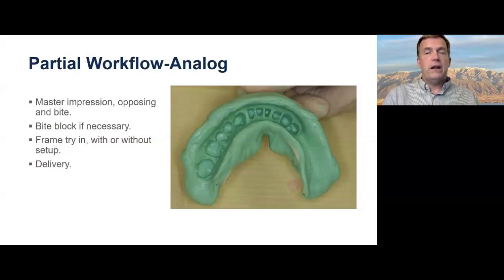If any of you have had to fit them, you know these are very difficult to fit. If they don't fit, you usually have to take a new impression and remake it. Somebody's got to pay for it. It's just not a good thing. So use polyether or PVS just like you would for a crown and bridge case, and make sure you capture all the vestibular borders. You need to give your laboratory enough space to make a nice partial for you.